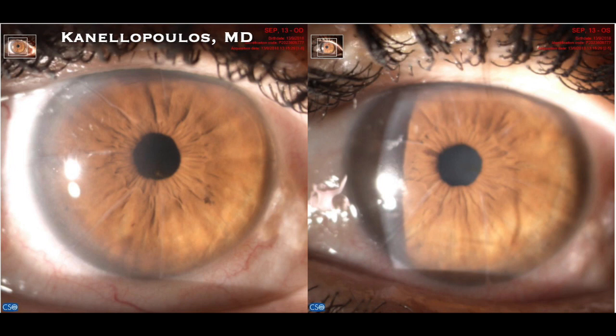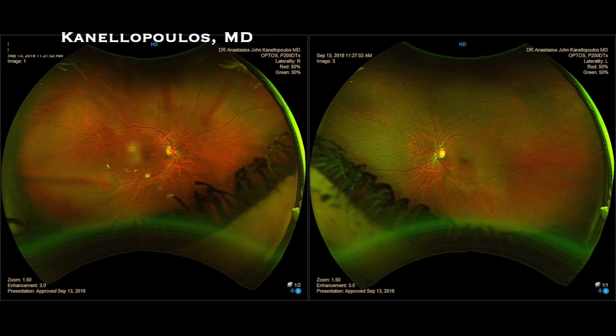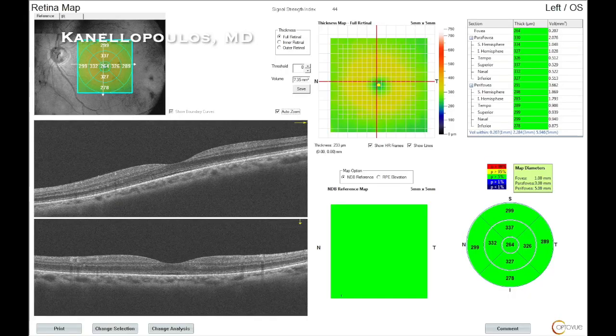This is a 62-year-old lady. Her right eye we had treated with cataract surgery several years ago. Her left eye has matured. You can see she's had the Russian-style RKs, eight-incision RKs. These are her fundus views, blurry on the left, and you can also see the incisions through the fundus view. Evaluation of the macula is standard for us — macula looks great.